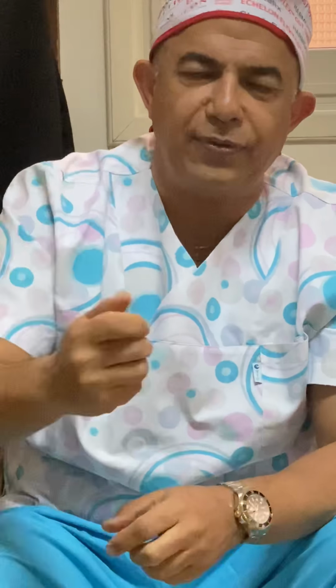And give it time. It's not like laparoscopic surgery. In laparoscopic surgery, you can irrigate and quickly you suck and you have the good view. But in hysteroscopy, you get frustrated. And many of my students, they get frustrated. No, we cannot clean the cavity. Just give it time. Time doesn't mean 1 hour. It's 2 to 3 minutes with the judicious use of inflow and outflow. Then when the cavity is distended well, check if there is any bleeding point.